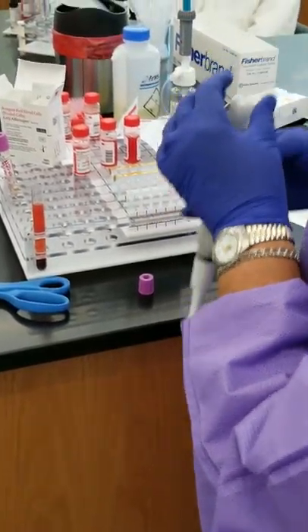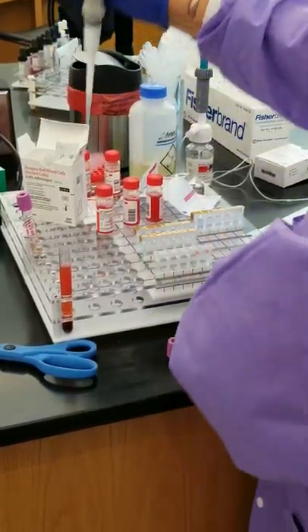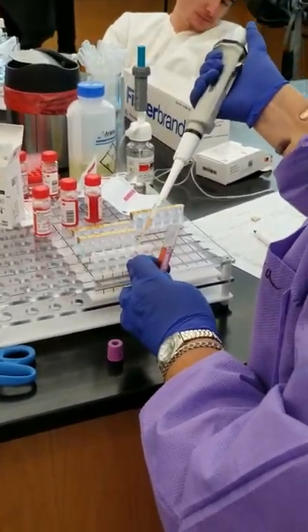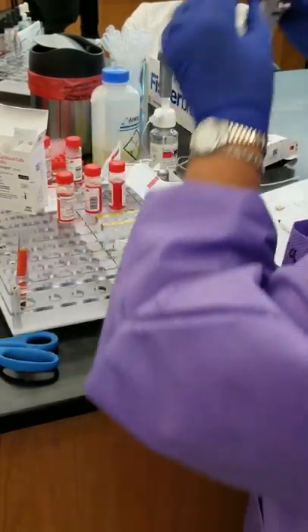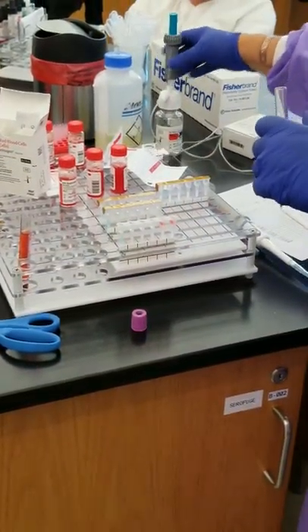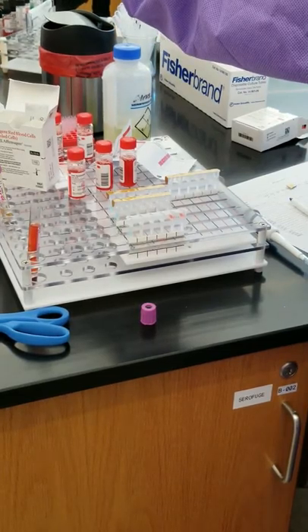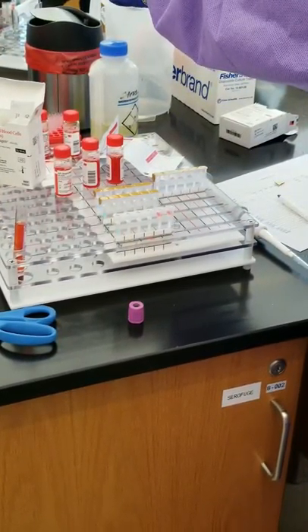I'm going to switch this to 25. I'm going to take my plasma. It's going to overflow. Oh, no. Put 25 in there and there. Okay. Then I'm going to flip it and leave it at 25. This is our diluent, which is sort of like saline. When you pass it, flip it this way a little bit more. It's been laying on its side for a while.